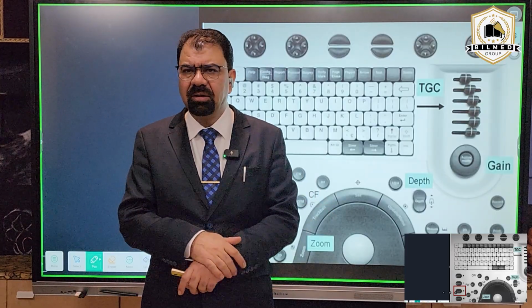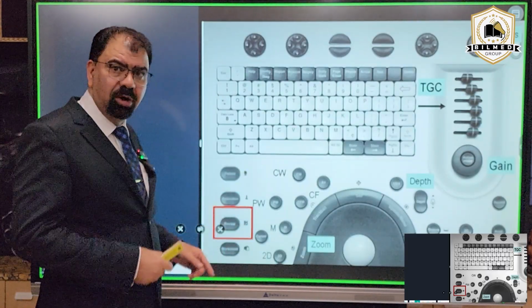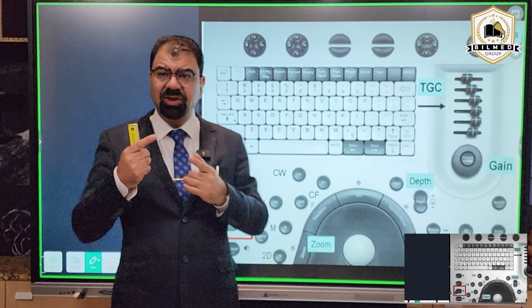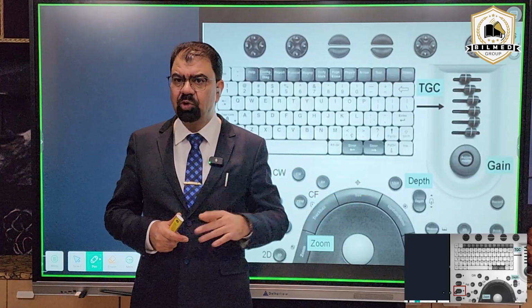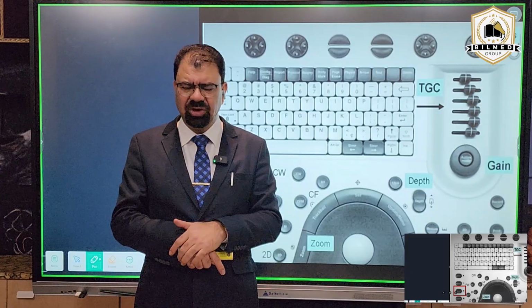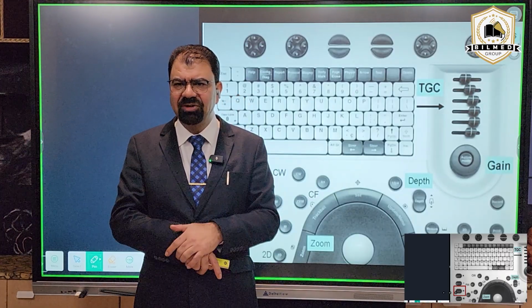What I mean by that, you are actually telling the machine by your commands. What is the command? Pressing these knobs. If you are haphazardly pressing this, the machine is getting confused. There is only one communication between you and the machine, and that is the knobs. These are actually the commands which you are giving. And you are pressing haphazardly here and there. The machine is getting frustrated. The machine is showing you a wrong image. Then you are cursing the machine, calling it a dabba. It is not actually a dabba machine. It is the dabba knowledge which the candidate is having.